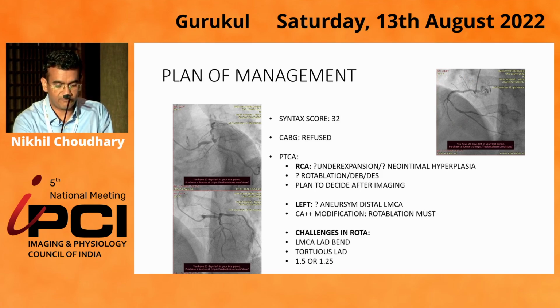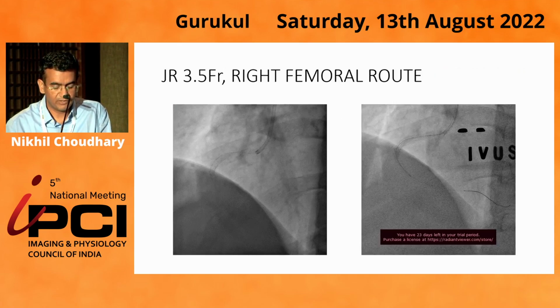For his left system, the challenges were the aneurysmal distal left main, mostly a post-stenotic dilatation, and calcium modification; of course, you'll all agree that I'll have to use multiple modalities. For rotablation, the challenge for me was negotiating this 90-degree left main to LAD bend, and of course, lower down, the very tortuous LAD. And of course, I was expecting all the complications you associate with rota.